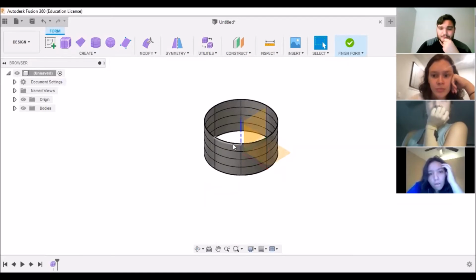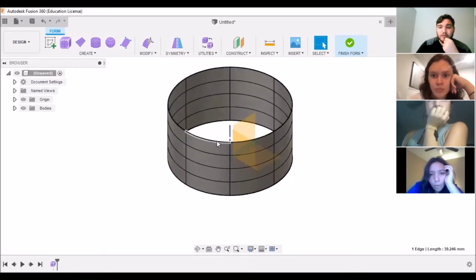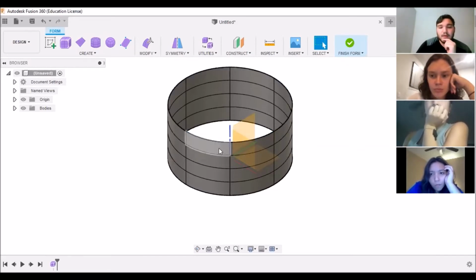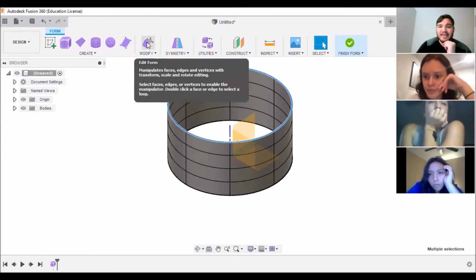So you can actually edit this as well. If you double click on the entirety of a line, it will highlight the entire circumference. I don't know if it's easy to see on my screen, but I take this section, click it once, and I get this section. But if I click it twice, it highlights the entire bit. From here, we can go to Modify and Edit Form.